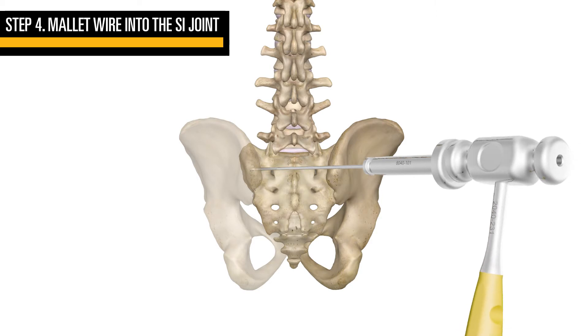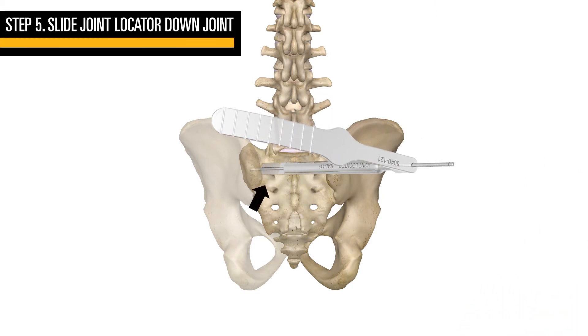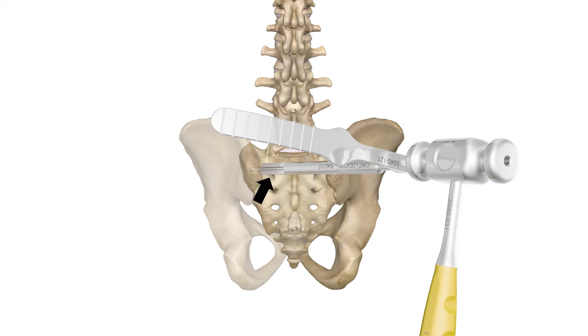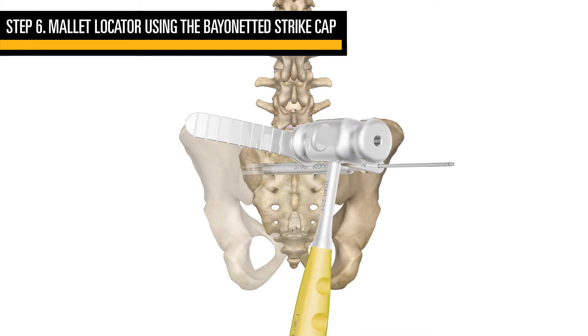Once the guide wire is positioned, slide the joint locator down the guide wire, making sure the crest cutout of the locator is positioned toward the crest. Using the bayoneted strike cap, mallet the joint locator.